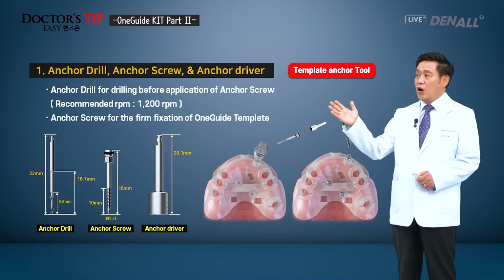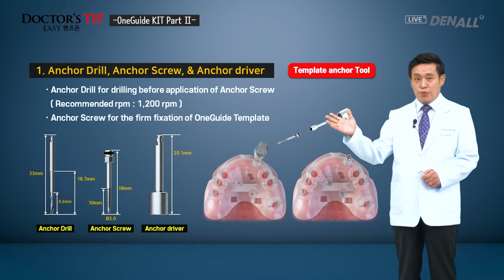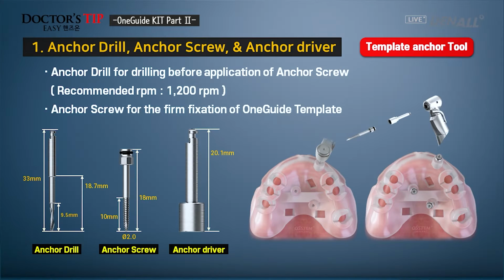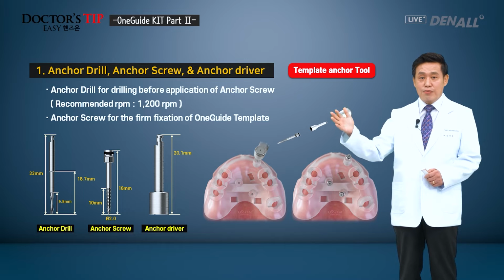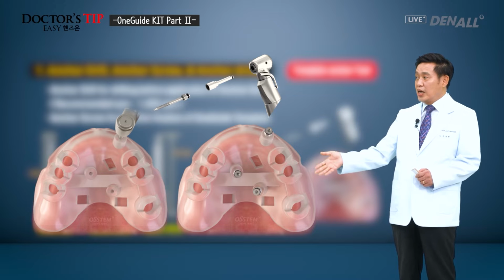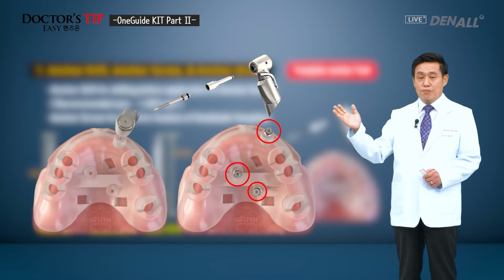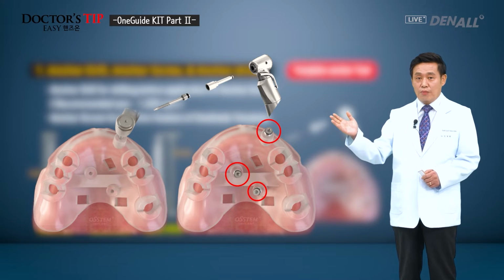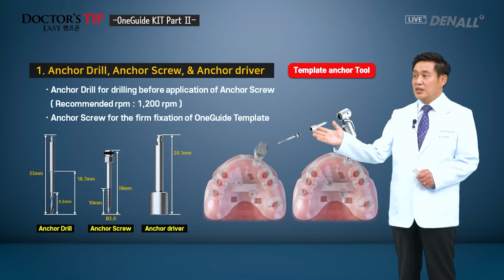As I mentioned before, OneGuide template needs to be fixated more firmly. In the case there are teeth, the OneGuide template does not really move, but in the case of edentulous cases, because of mucosa's resilience, the template can be deviated. In those cases, using 3 anchor screws on palatal and buccal, you'll be able to accurately fixate the template. It can be done firmly. Anchor screw is used for this.